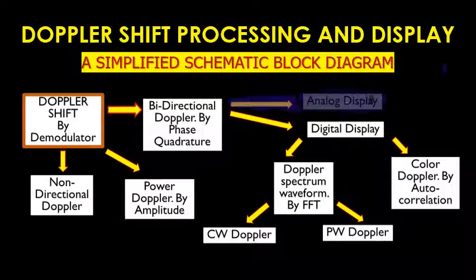This one is known as Doppler power imaging or Doppler power angiography. So this is again the second application. The third application is not famous in our ultrasound system, actually it is a separate one, and we'll discuss this in the next slide.